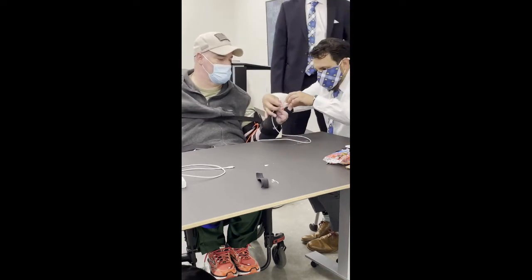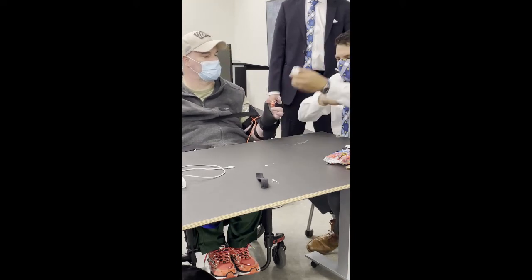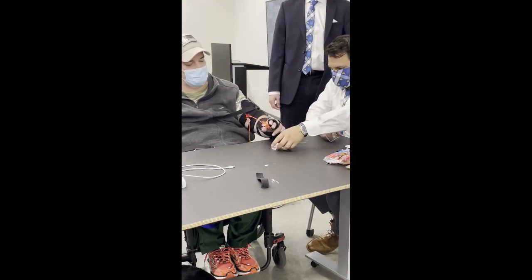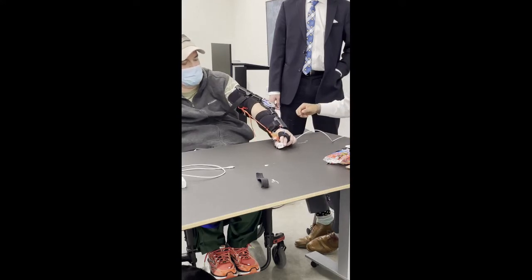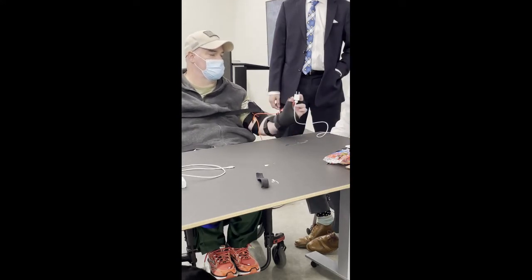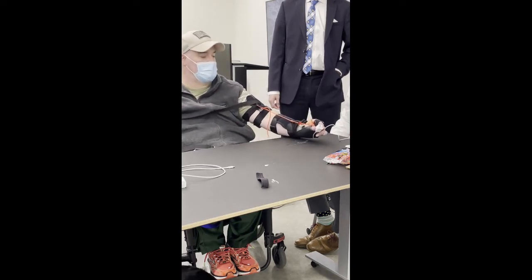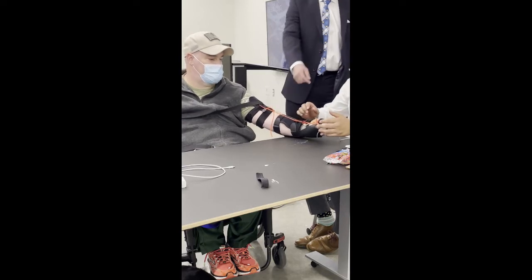I think the cord is twisting around. Try to hold it as much as you can.